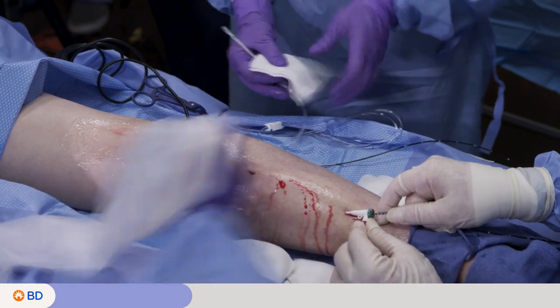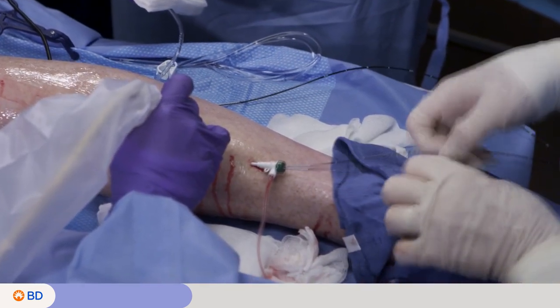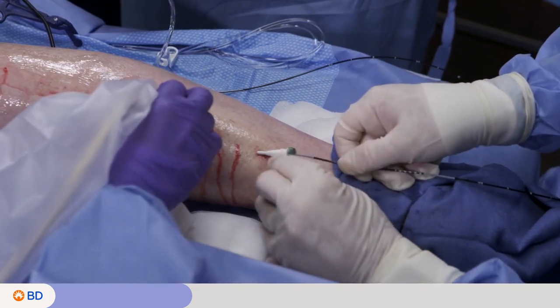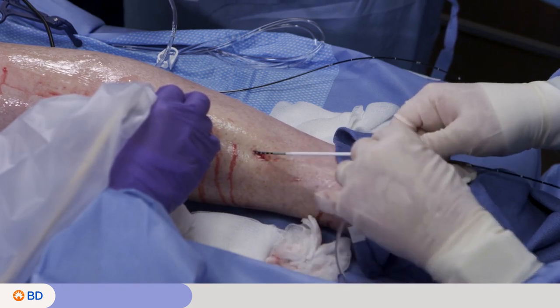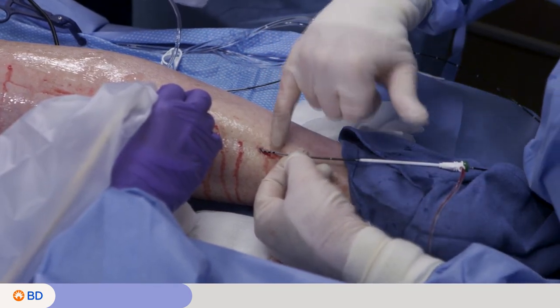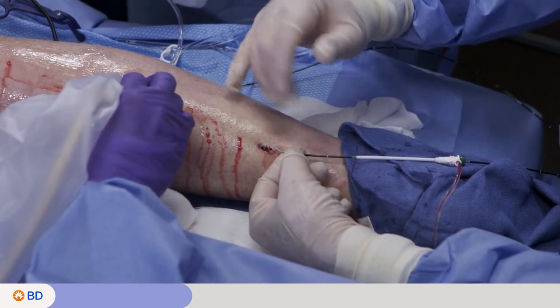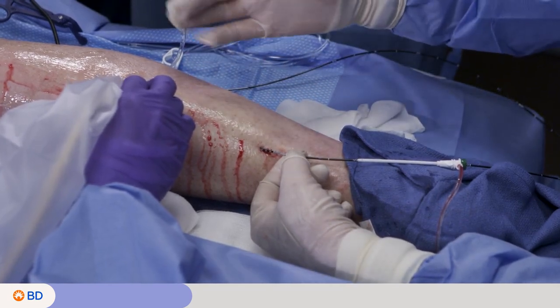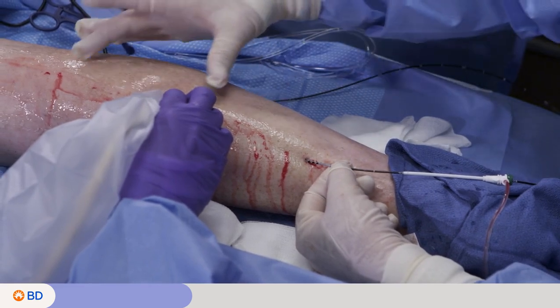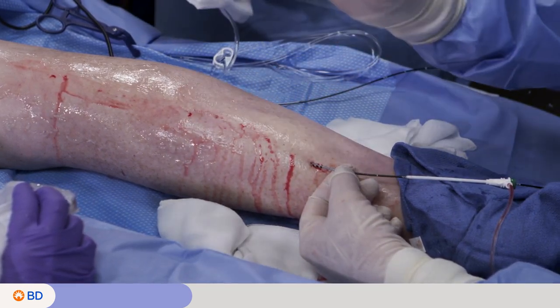I pull back again — we treated that segment — and now it's very important as you get past the warning track that you don't treat without seeing your coil. I anchor the catheter and pull the sheath out of the body without moving the catheter position. I now see the other warning landmarks and have the double X, so I know the end of the catheter is very close. That's too far down to treat, because we're approximating the sural nerve branches in this area and it's very close quarters to muscles and tendons. So we terminate on the small saphenous just cephalad to that bifurcation of the gastroc and away from the sural nerve.